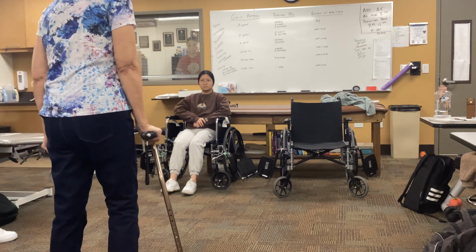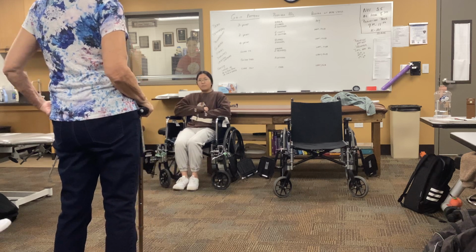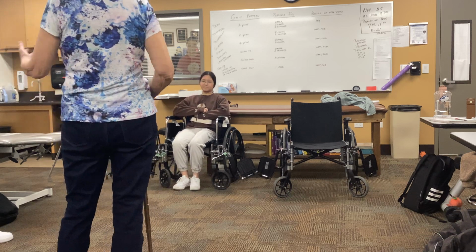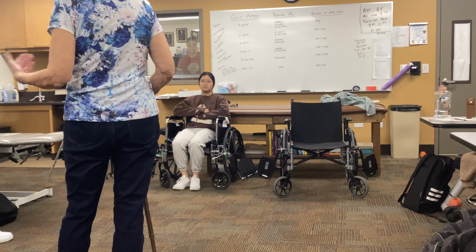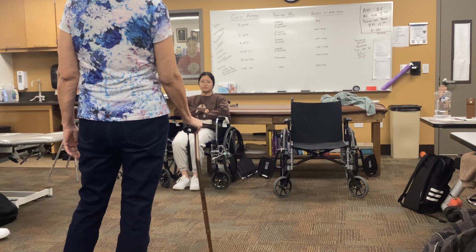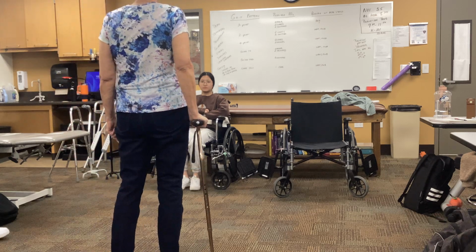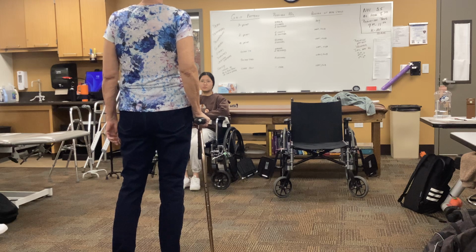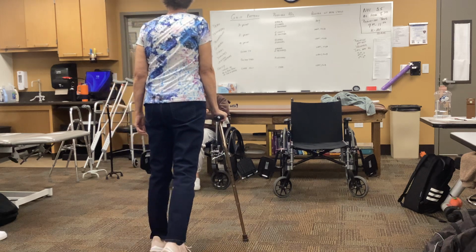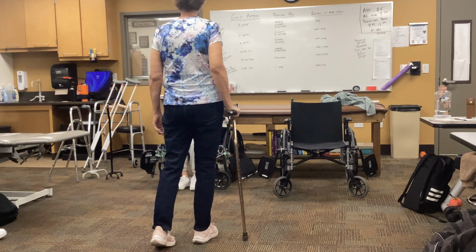Okay, so this is how it supports me and allows me to relieve pressure. Remember I said we don't really call it relieving weight bearing, but pressure. So by putting it on the good side, I lean on it as this leg is taking some of the weight and this leg is stepping through.